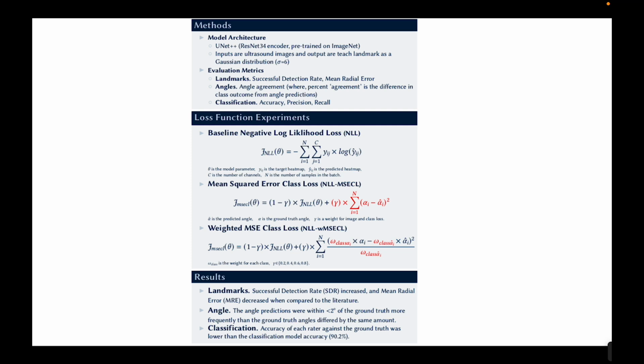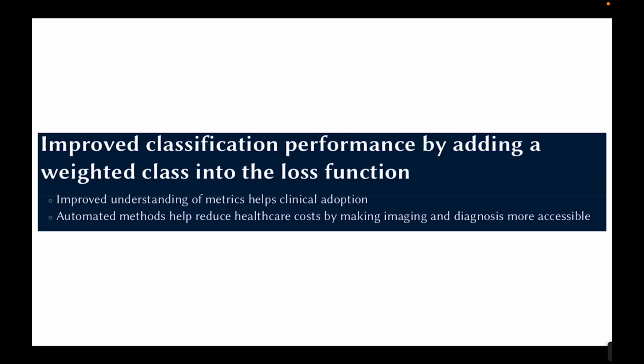This work shows the improved classification performance by adding a weighted class to the loss function. It improves understanding of all metrics within the clinical pipeline, which can aid clinical adoption. Automated methods can help reduce healthcare costs by making diagnostics more accessible.